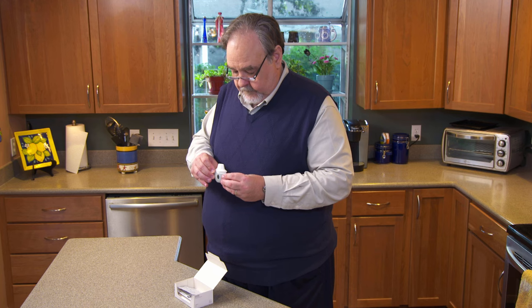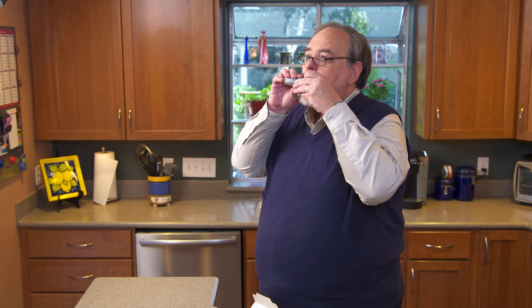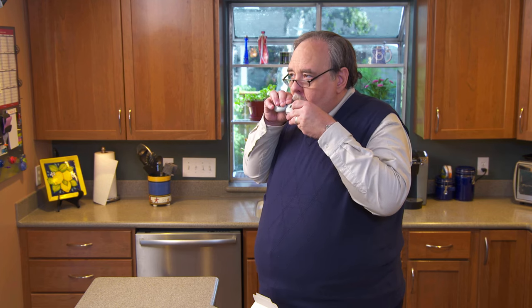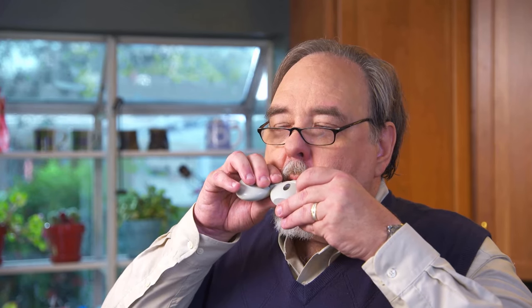Hold the HandiHaler upright and try not to shake it. Breathe in deeply, then breathe out, making as much room in your lungs as you can. Lift the inhaler to your mouth and place your lips tightly around the mouthpiece — be careful not to cover the air holes. Now breathe in deeply until you have a full breath. Hold your breath for 10 seconds, or as long as you can. Take the mouthpiece out of your mouth, then exhale slowly. Repeat the process one more time using the same capsule already inside the HandiHaler, just to make sure you have inhaled all of the medicine.